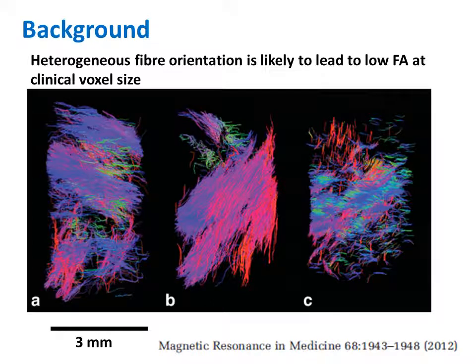One thing to notice from these microimaging studies, if we look at a largish volume of tissue, and in this case we're looking at 3 different tissue cores that are about 3 millimeters diameter and 4 millimeters long each, we can see that although we have quite a high anisotropy on a small spatial scale, most of these tissue cores actually have quite a variety of fiber orientations within them, and each of these tissue cores is similar in size to 1 or 2 typical in vivo voxels.